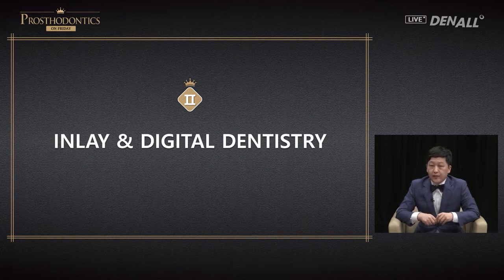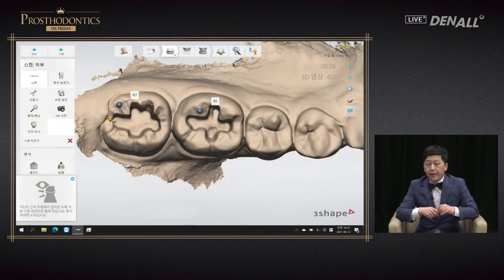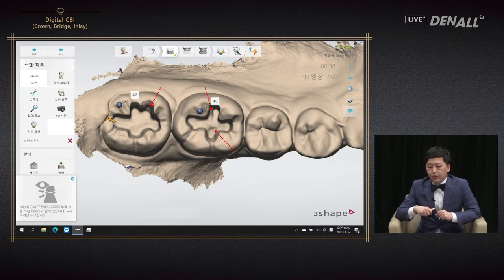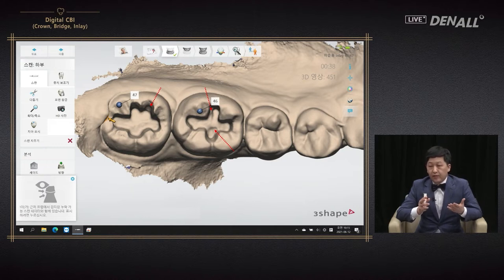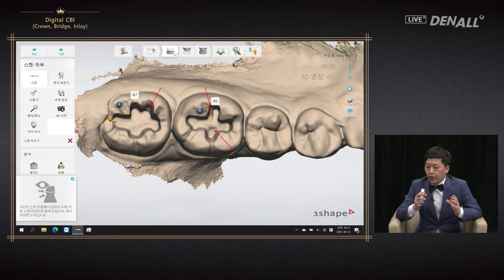Let's look at the process involved in inlay using digital dentistry. There was caries in numbers six and seven with existing resin. Prep was done and scan was done — as you can see in red, the prep was quite insufficient. When we take impressions using analog methods, these deficiencies are not shown well. But using digital technology, after scanning you can check what is insufficient, adjust again, and do re-scanning very easily, making impeccable preparation possible.